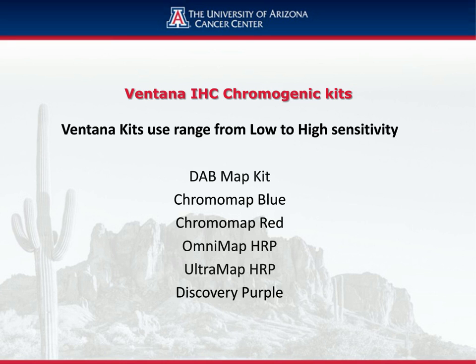If I have a protein that is relatively low expressing, I will use the Ultramap HRP.